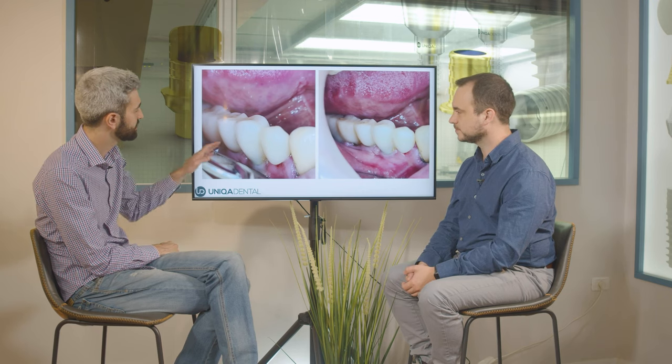Here it rests on the gingiva — it rests a little bit. It's hard to tell from the picture. Right now it's a PMMA bridge, but later on, of course, we'll make it from zirconia or any material you want.